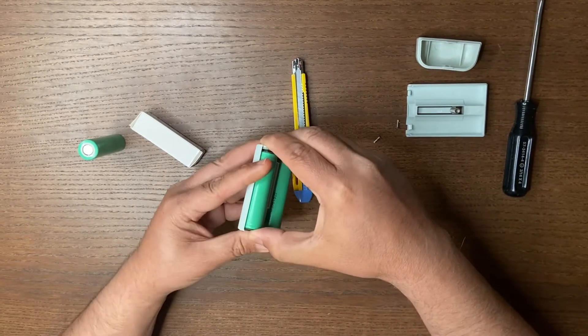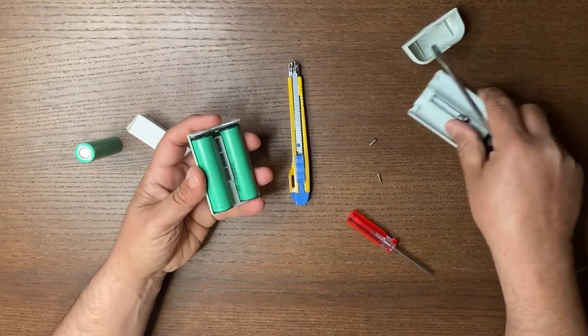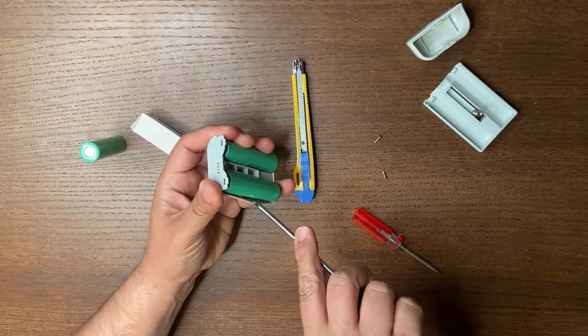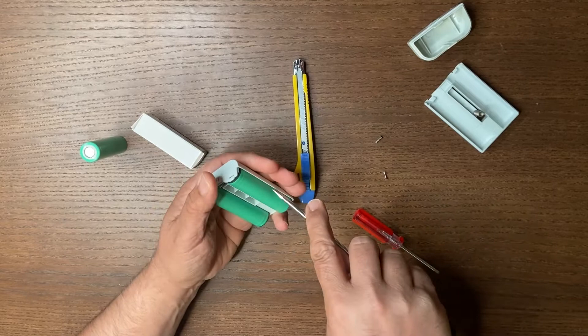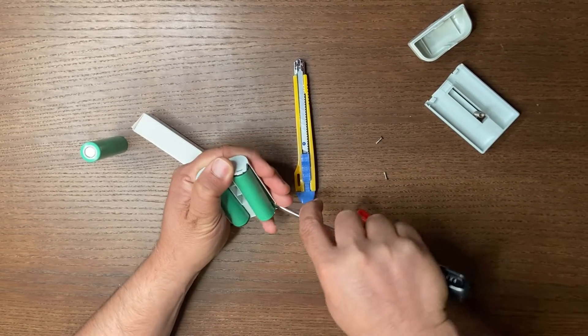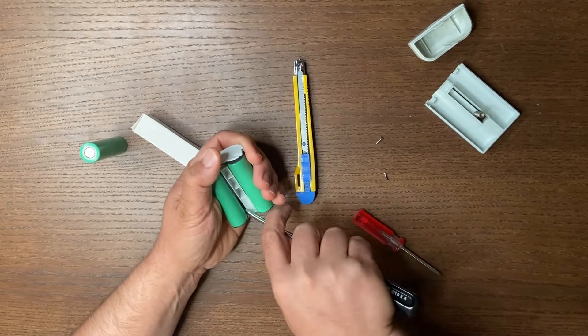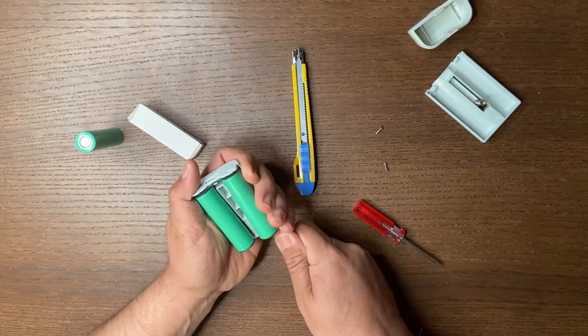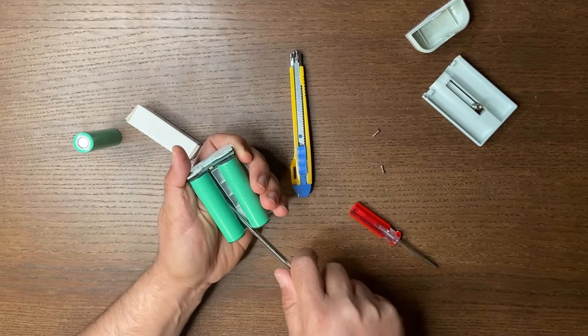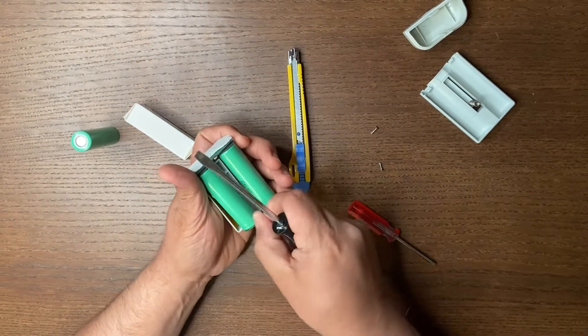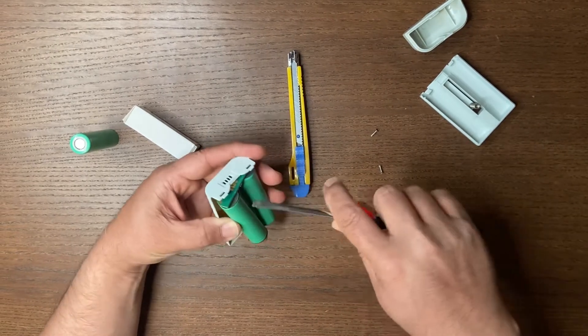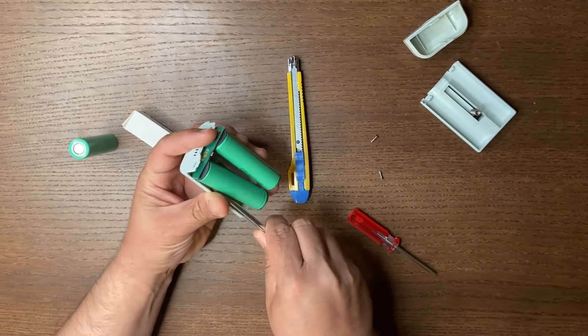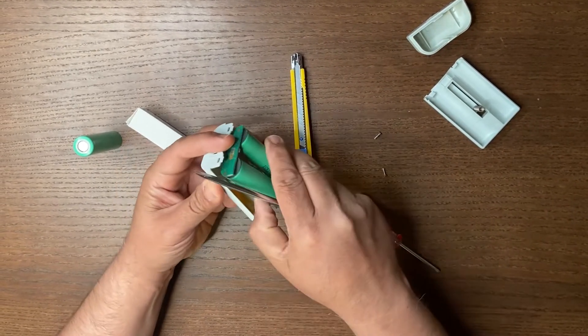With the board, we need a straight screwdriver. Take it out. You can use the side because it's already glued to the cover, so we need to remove the glue. Now we have the battery pack which is composed of a small board and two batteries.